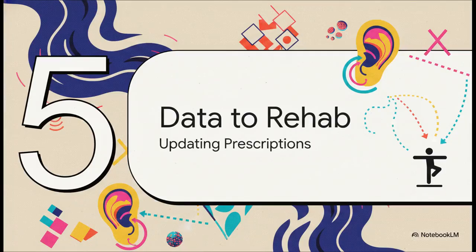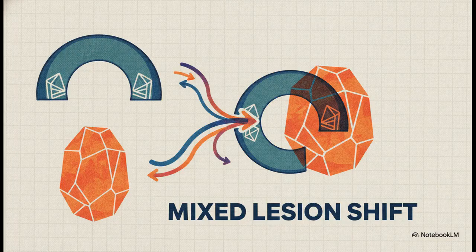Section 5. Translating data to rehab. So the big question, how does finding an abnormal VEMP or SVV actually change your exercise prescription? Why does it matter for your day-to-day practice? Well, the main takeaway is that an absent or highly asymmetrical response completely flips your patient's deficit profile. You're not treating a pure canal lesion anymore.